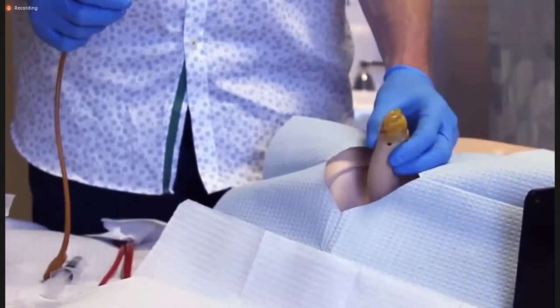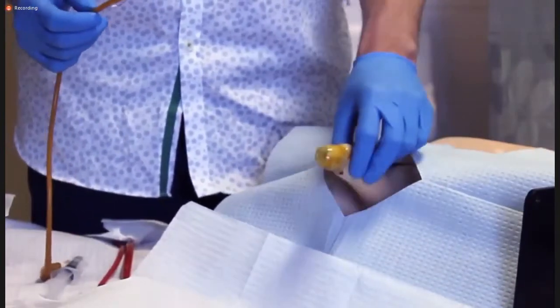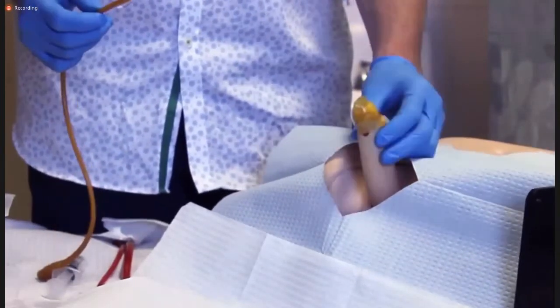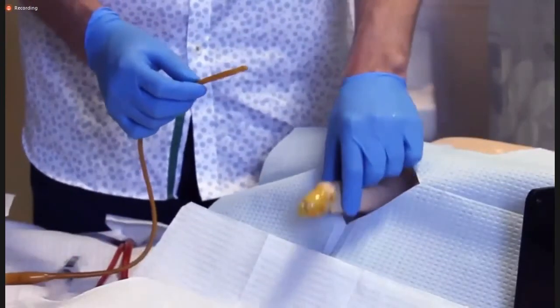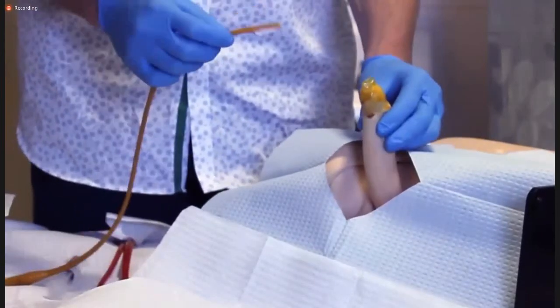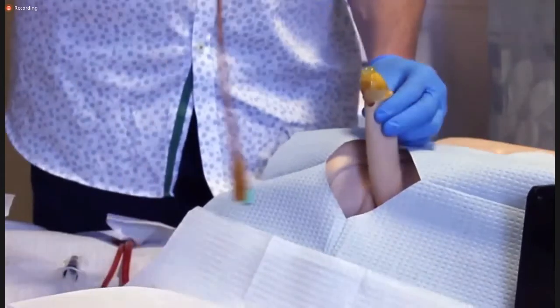When you grab the male penis and urethra, it's very important that the penis is pulled straight up and on stretch, because the urethra has a curve to it. And if you just leave the penis hanging and try and put the catheter in this way, it will be very difficult. So one of the key points is to put it on stretch, pull up to the ceiling as far as you can without hurting the patient. And then subsequently, with your well-lubricated catheter and a steady pressure, introduce it into the urethral meatus.